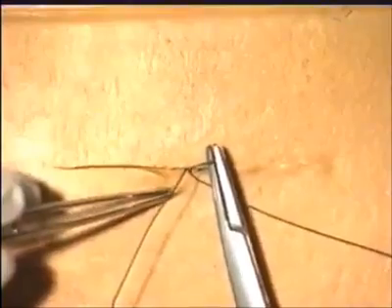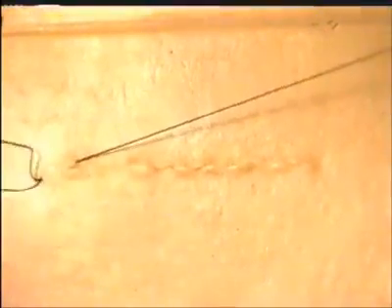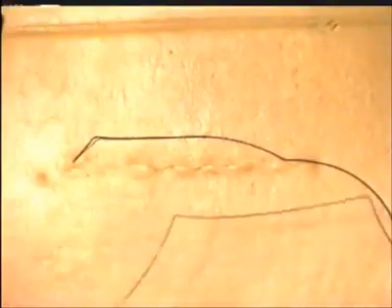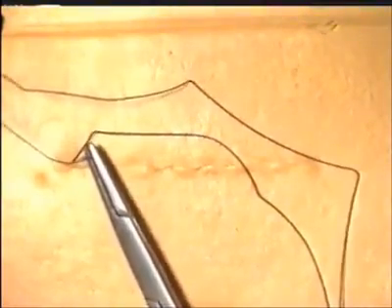You can see here a needle going in, just at the skin edge. Taking a bite of the subcuticular tissues, and coming out at the skin edge. At the end of the incision, the needle can be exited about a centimetre away from the edge, and then the needle reversed, and passed back, almost through the same hole in the skin, in the opposite direction. This can be repeated, passing the needle through the same skin hole, back again, and then cut.